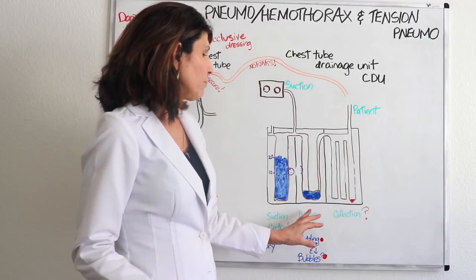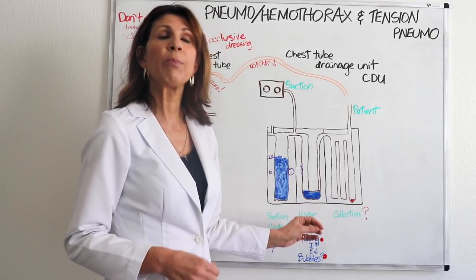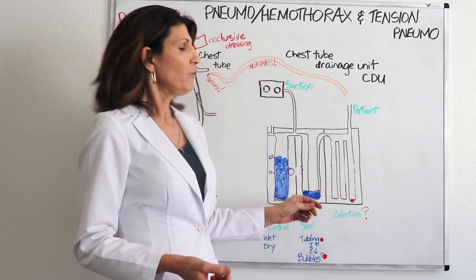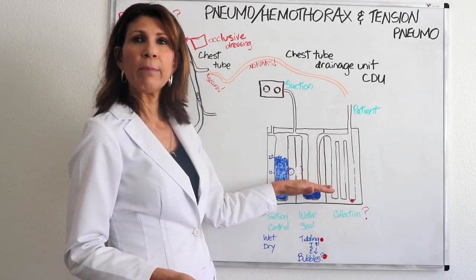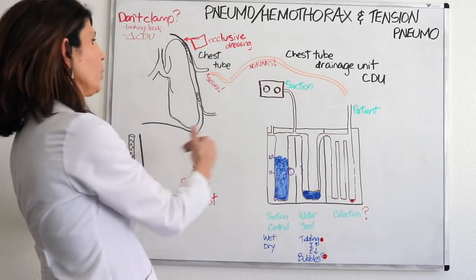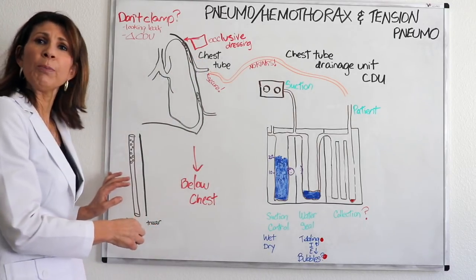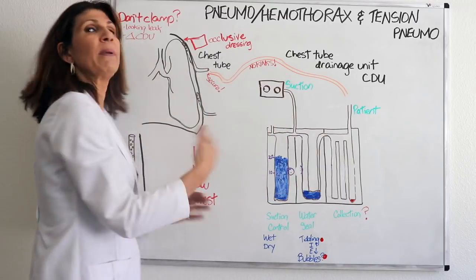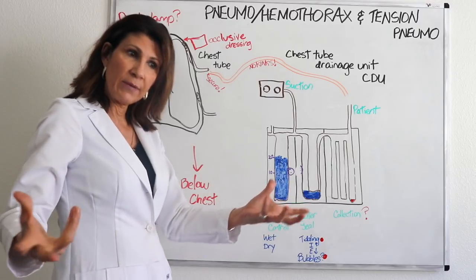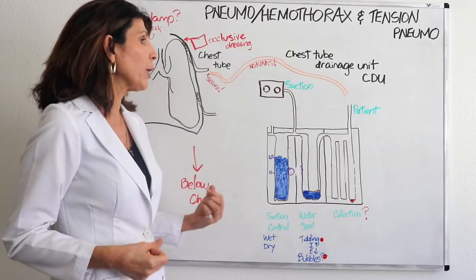Water seal chamber. Okay, so the water seal chamber does just that. It provides a water seal. What do I mean by that? Well, if you didn't have this water seal chamber, what would prevent air from just going right back up, depending on where the opening is that goes into the pleural space, and being pulled back into the pleural space? Nothing, because the chest has that negative pleural pressure constantly trying to pull air into it.